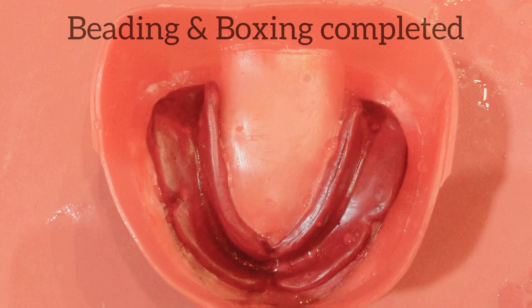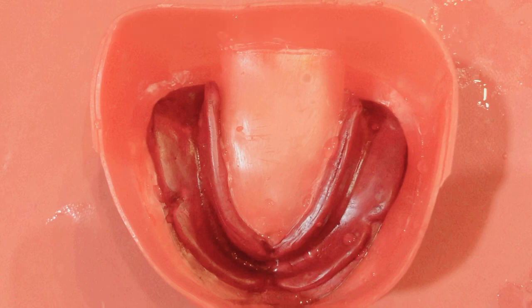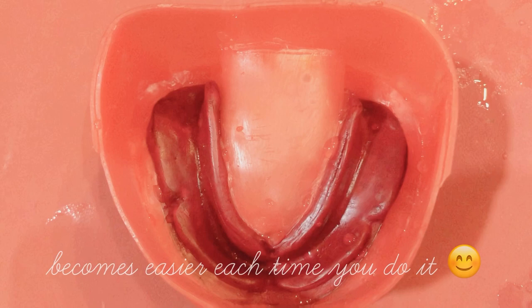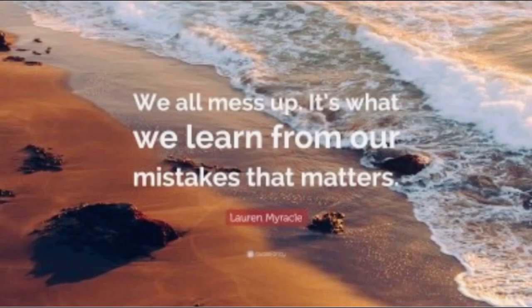You may mess up slightly the first time you do this procedure, especially the mandibular tongue space, but no worries. You just have to try it once more. Signing off for today.